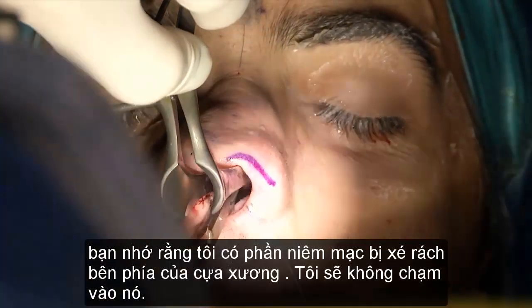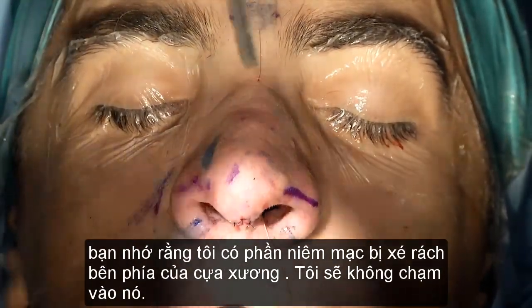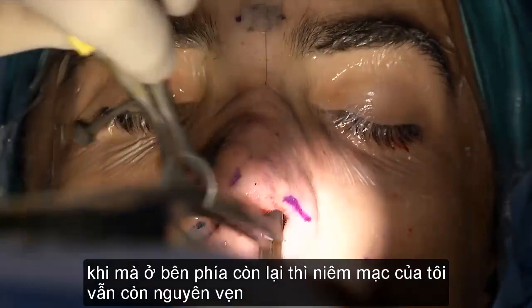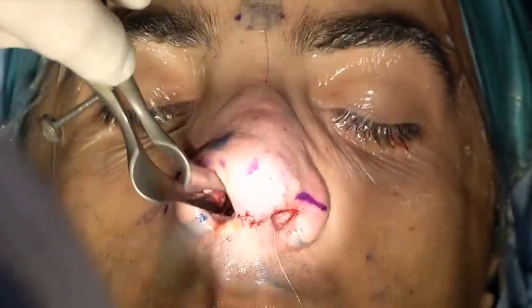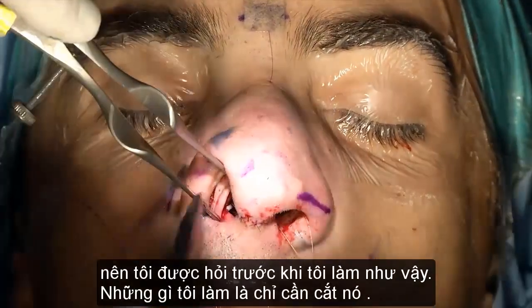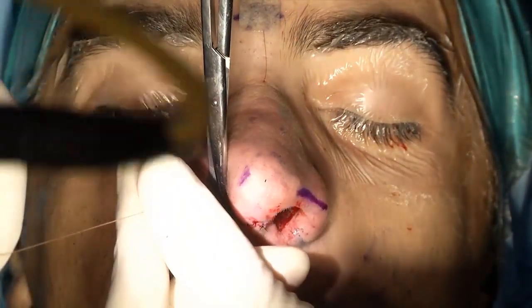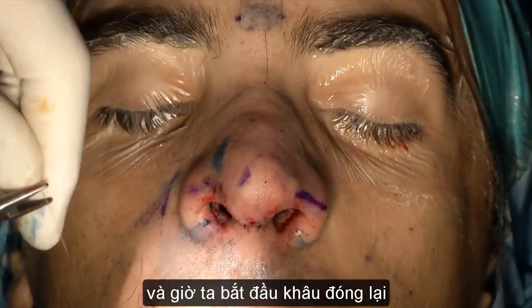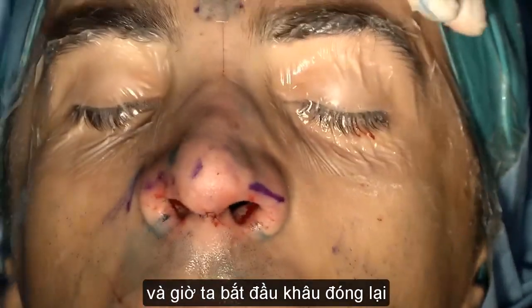You remember I had a mucosal tear on the side of the spur. I won't even touch it, since on my other side my mucosa is fully intact. So I was asked before what I do with it. I cut it, and that's it. Okay? So, let's start the closure here.